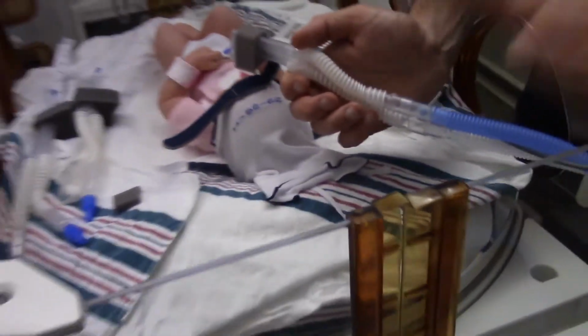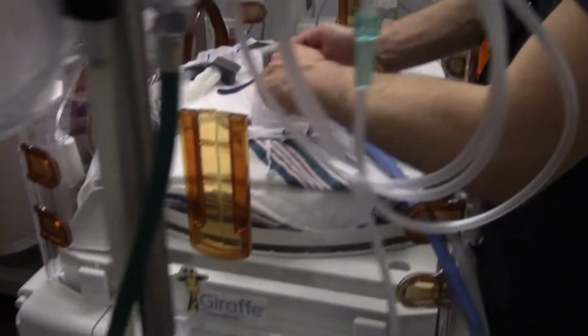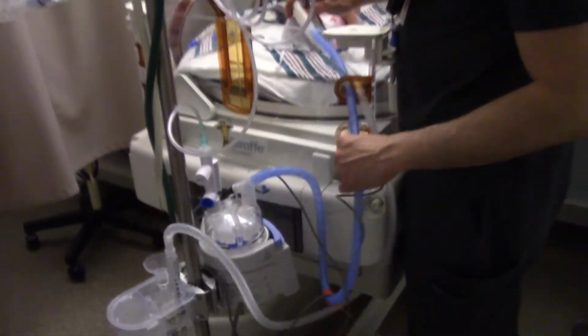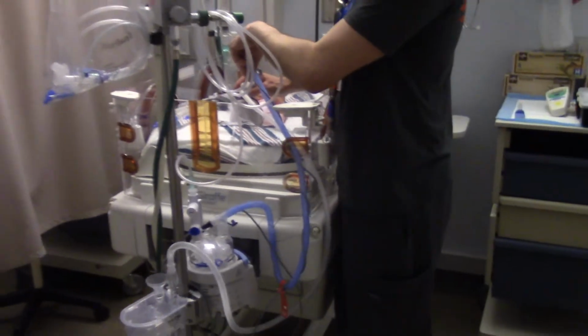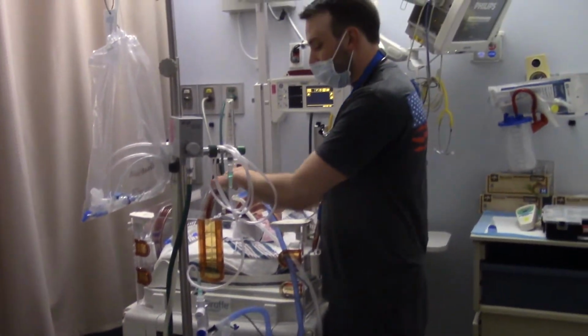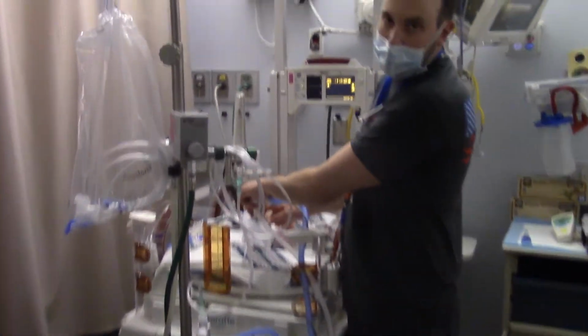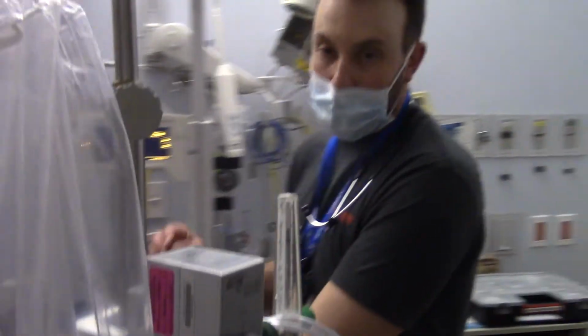If we have it too high up, that's just more work for the machine to do, more work for the baby, and we run the risk of lavaging and sending any kind of condensation down into the baby and lavaging them. Okay, and with positive pressure and a driven flow, you can almost guarantee that you're going to send that condensation straight into the baby's lungs, which we do not want.